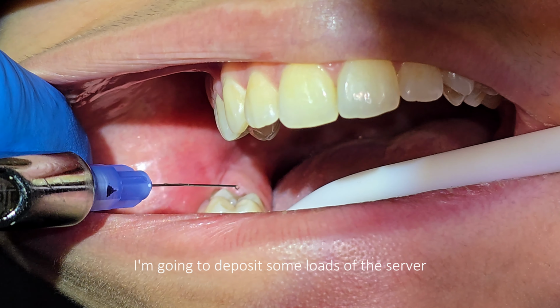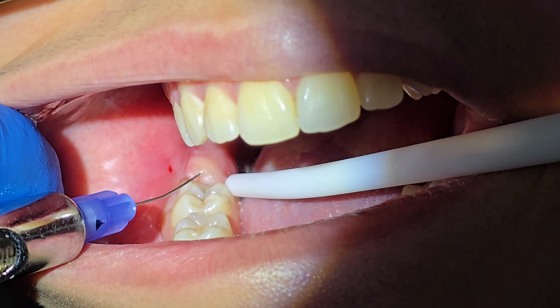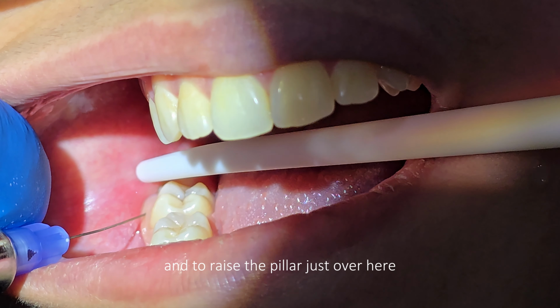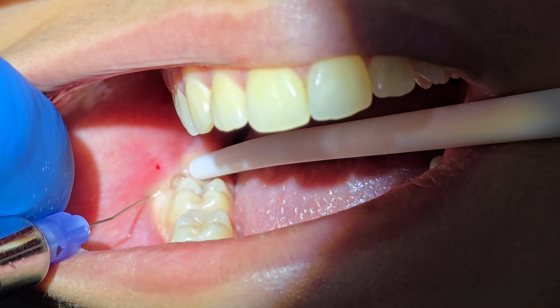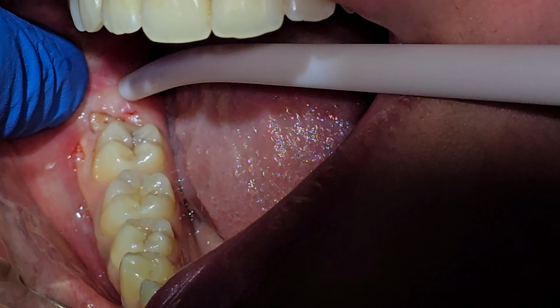I'm going to deposit some local just over the operculum, and to raise the papilla just over here. Well done. Excellent. Well done. External oblique ridge.